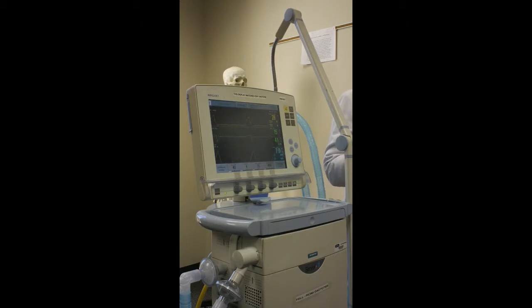Now the next section we're gonna do is set parameters. So mode is gonna be the mode that the patient's in. What are some examples of the modes that we've talked about? ACVC, ACPC, SIMV. Sometimes patients will be just on pressure support. That's what goes there.